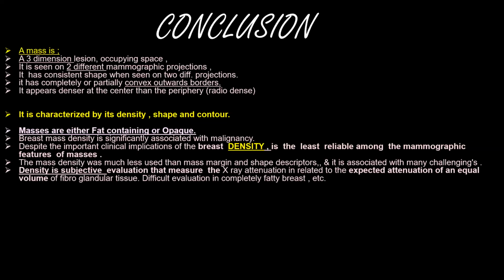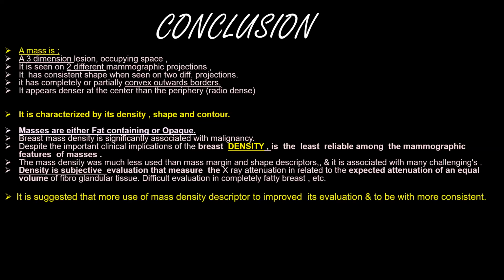It is just subjective evaluation, and it is difficult to be evaluated in completely fatty breast, among other challenges. Still, it is suggested to use mass density more as a mammographic descriptor, to improve its evaluation and to be more consistent.